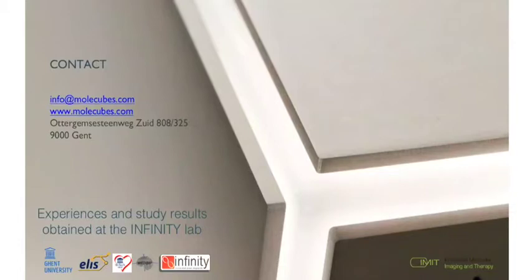The contrast stays more or less in the blood for, let's say, 6 to 8 hours, and then you will see more and more uptake into the liver.